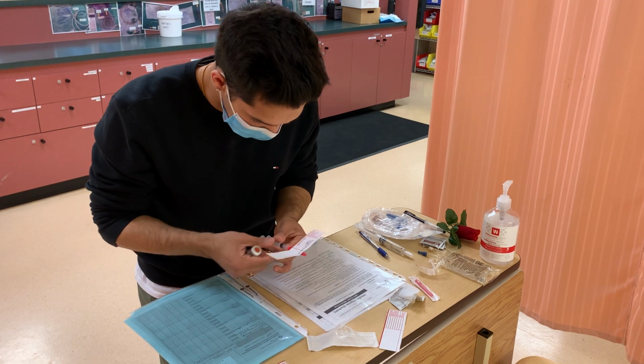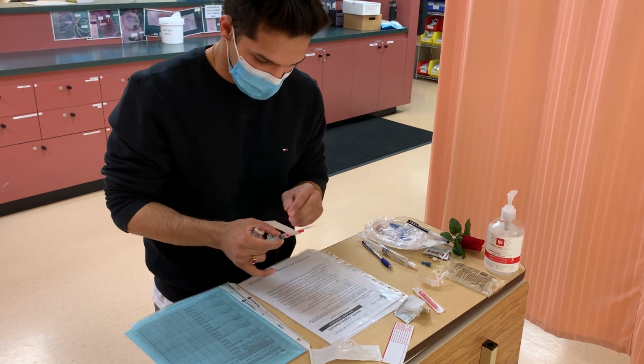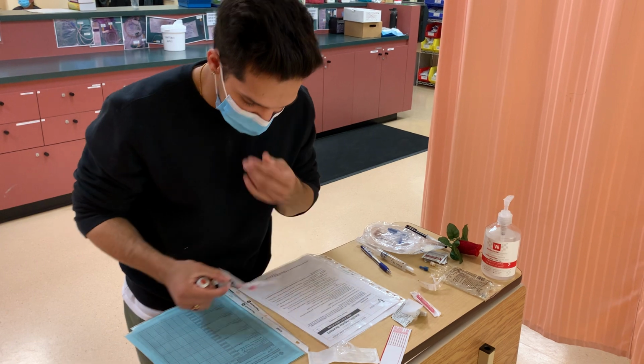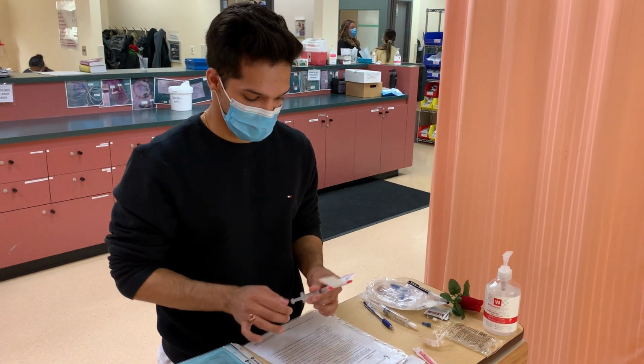And then after that, the route for this medication is IV. That's IV, and then this is the IV continuous, and this is also IV vial, and it indicates it right here. And then the time and frequency of this medication is due to be given today and now, and nobody's given it, so I will be giving that.